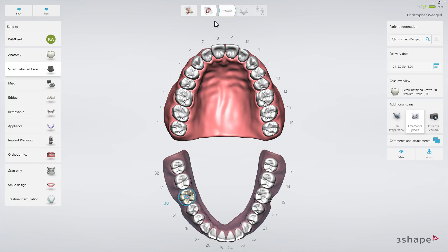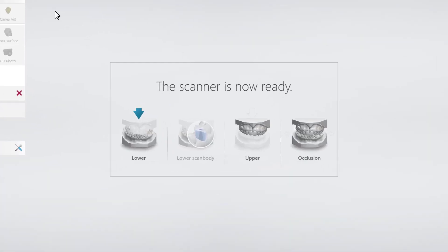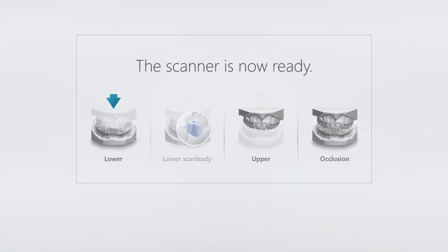Now proceed to the Scan page. If you selected Emergence Scan, you'll now have to perform four scans: lower arch, lower arch scan body, the upper arch, and finally the occlusion.